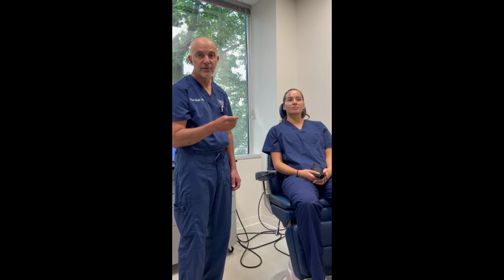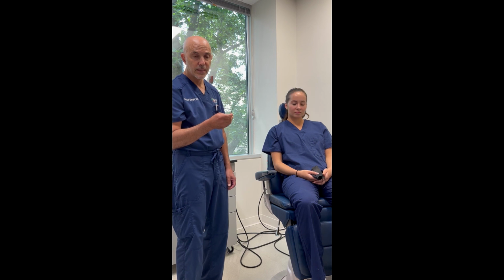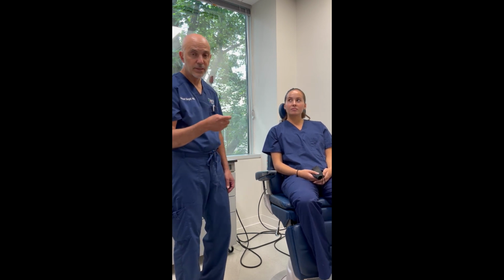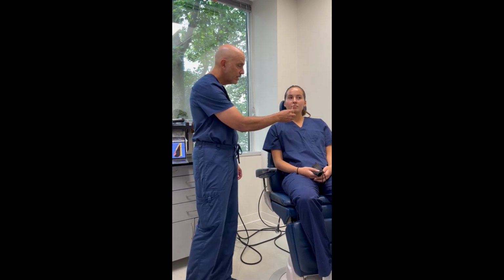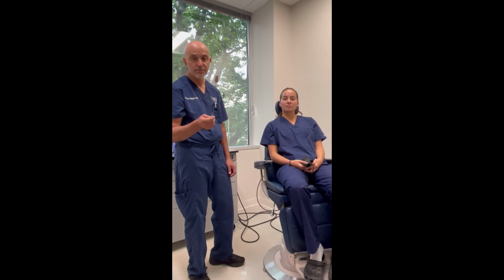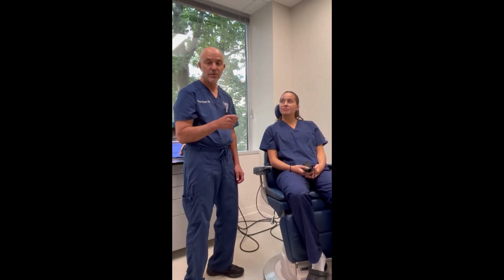I've been a big fan of it for a while. There's not a whole lot of complications from it. There's not a lot of pain from it. But you do need to use an ointment in your nose after the procedure, and you have to put it right into that area on the inside twice a day for 6 weeks after the procedure. So that's it for the VivAer procedure.